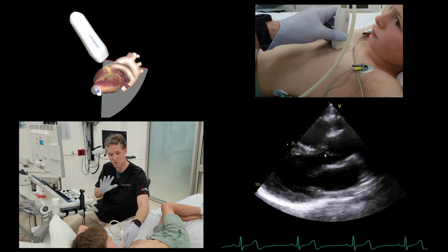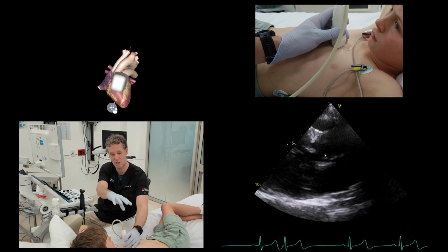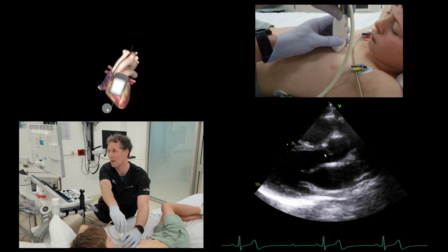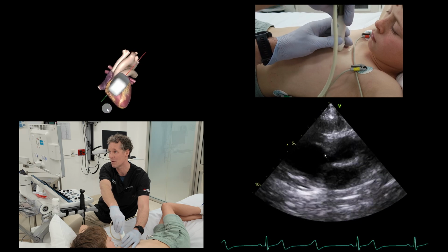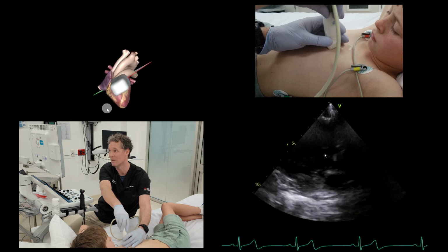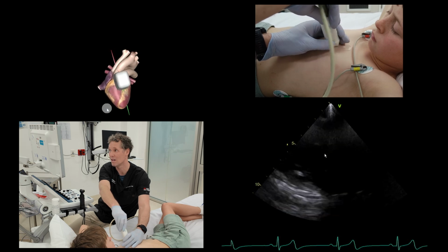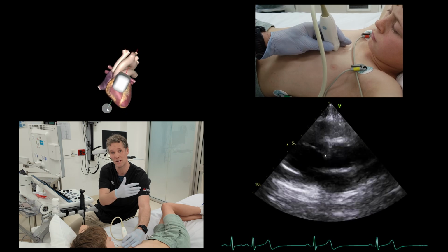The next movement is rotation. I try and use my left hand to hold the same position, and then I rotate with my right hand. And whatever's in the middle of your screen on one plane, like here's the aortic valve again in my parasternal long axis view, as I rotate round, it stays in the middle of my view on the next image. Let me try and show that a little bit better. So here, if you've got the aortic valve in the middle of my screen in one view, if I rotate round, the aortic valve's in the middle of my view on the next view.